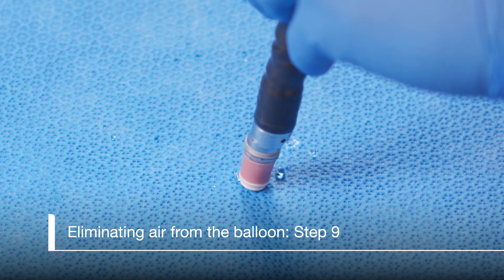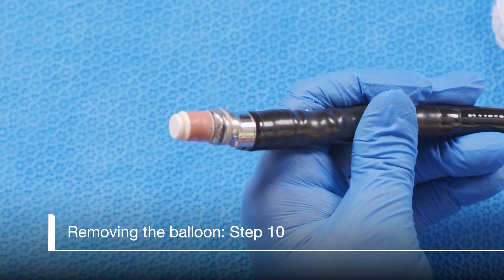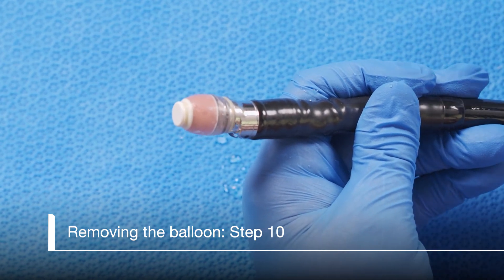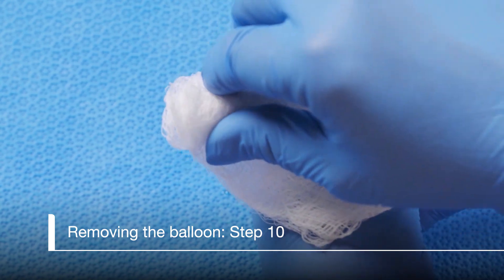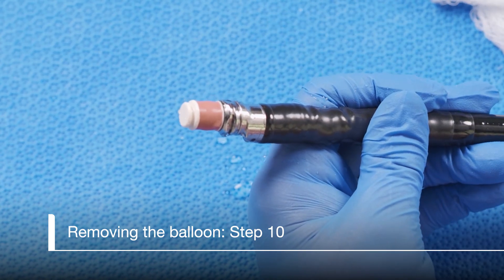The scope is now ready for use in the procedure. Next, let's talk about removing the balloon at the end of the case. Inflating the balloon with water slightly will make this easier. Holding the end of the scope securely, cover the balloon with a 4x4 to prevent splashing. Pinch the balloon and quickly remove it from the tip of the scope and discard. Do not pinch or pull the scope — only the balloon.